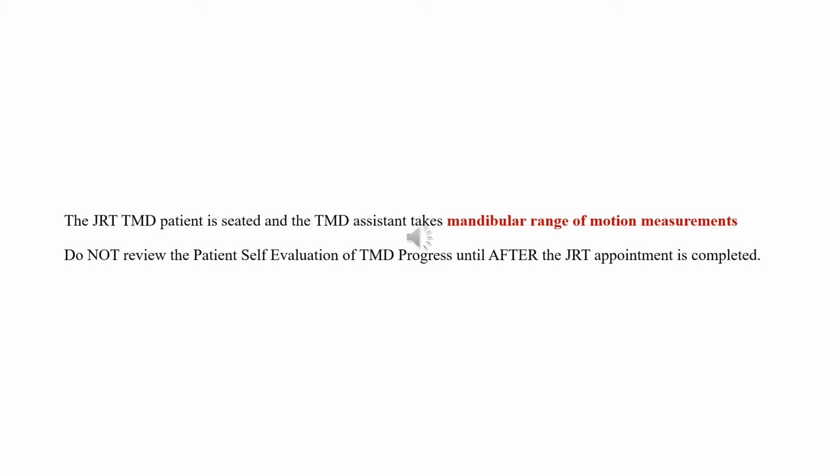We don't want to be what we call distracted and answering patient questions because we won't get what we need to get done. Then the patient will be mad at us for not getting in the real TMD appliance, because the soft guard is not the real appliance. I'm going to repeat. The soft guard is not the real appliance.